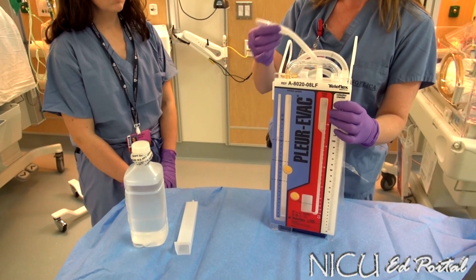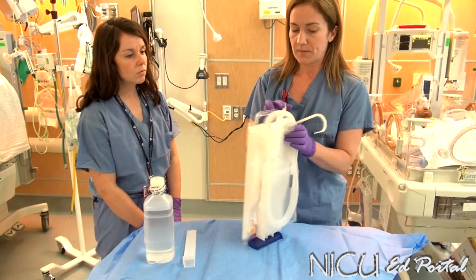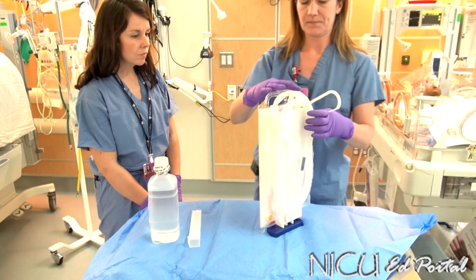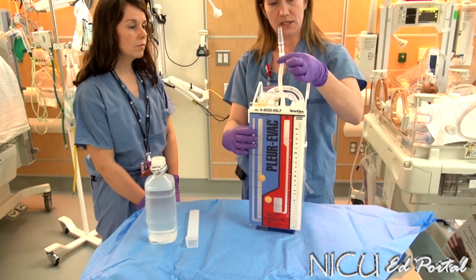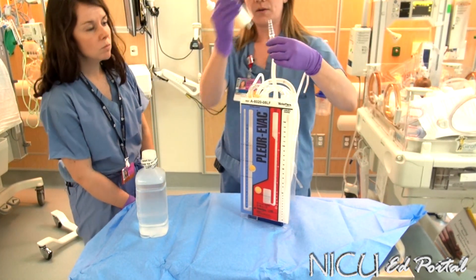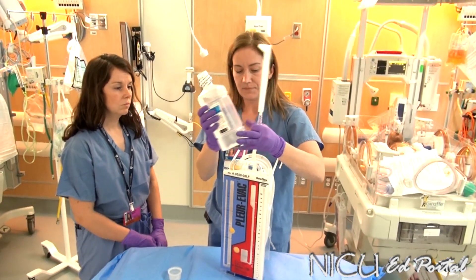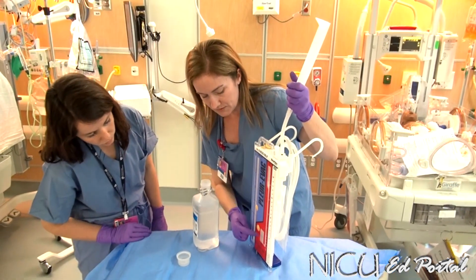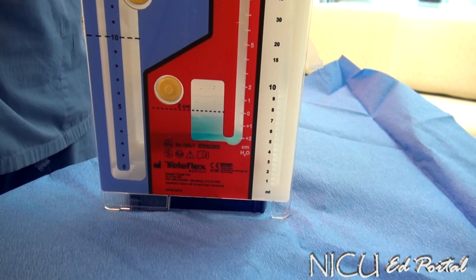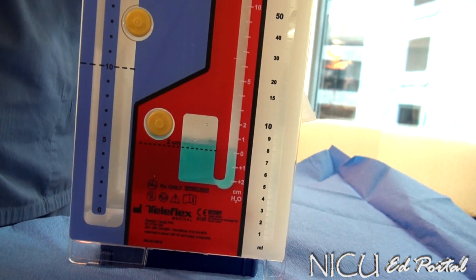When you take it out of the package, make sure you're familiar with each port. This first port is what we're connecting to the baby — this blue tip is keeping the end of that drainage system sterile. This port here is where we're going to fill the water seal chamber up to the two centimeter water line. I'm going to put my funnel on, open up my water, and pour to the black two centimeter line. Have someone let you know when it reaches that mark, because the funnel fills up sometimes quicker than the chamber.